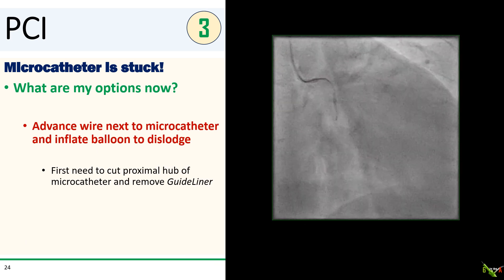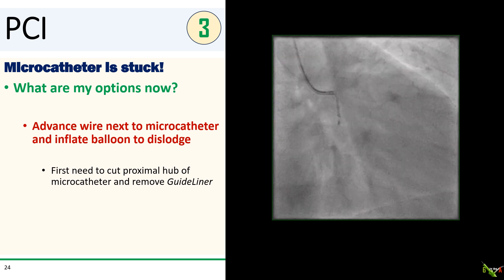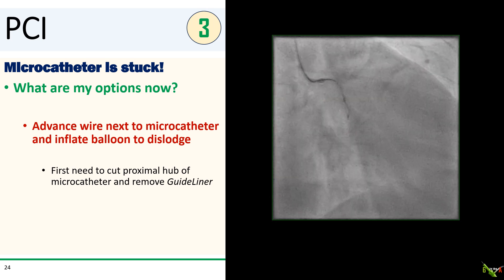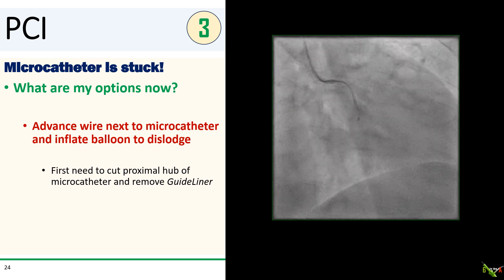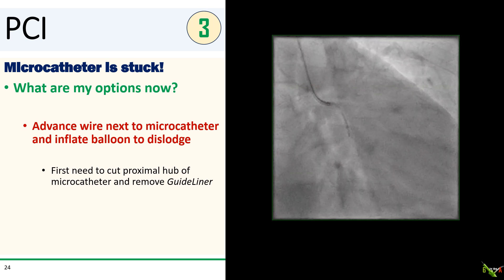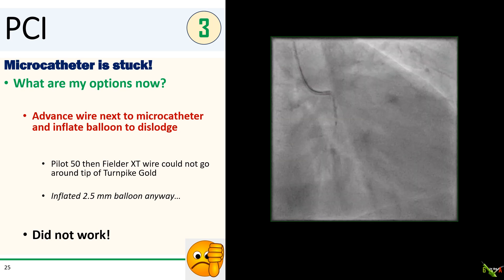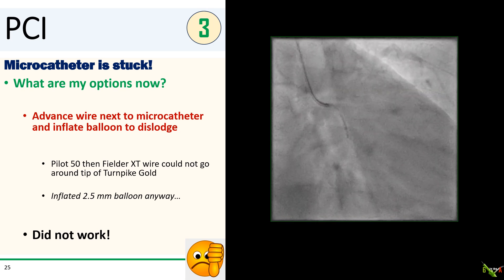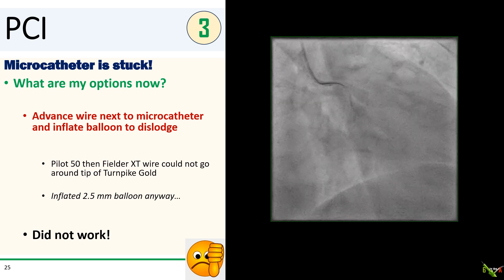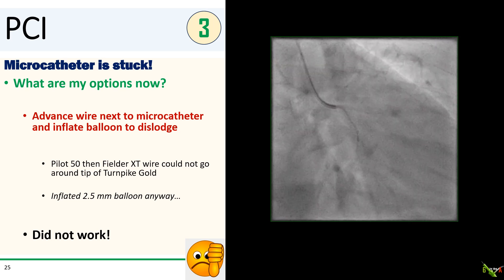So at this point I thought I would try something that sometimes works for entrapped Rotablator burrs — I was going to advance a wire around the tip of the Turnpike Gold and inflate a balloon next to the tip to dislodge it. But first, we had to remove the guideliner, which was already over the shaft of the Turnpike Gold. To do that, I had to cut the proximal hub of the Turnpike Gold to get the guideliner out. After removing the guideliner, I tried to get a Pilot 50 wire to go around the tip of the Turnpike Gold, but the wire could not cross. I then tried the XT wire, thinking it had a finer tapered tip, but that was also unsuccessful. I decided to inflate a 2.5 mm balloon in the circ as close as possible to the tip of the Turnpike Gold anyway, but that didn't do anything — the microcatheter was still stuck.